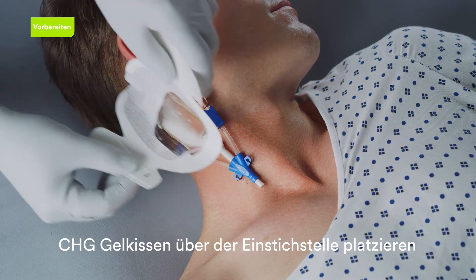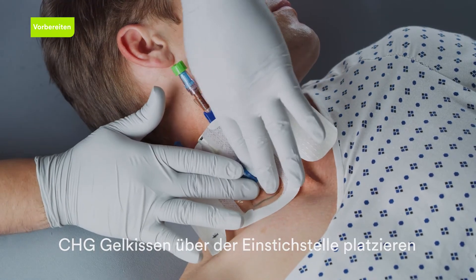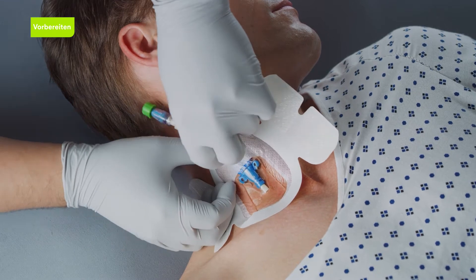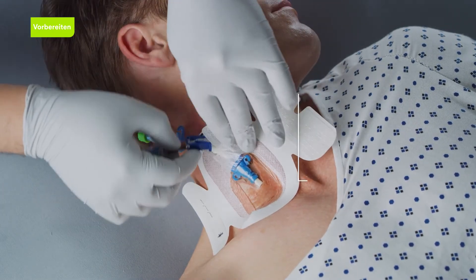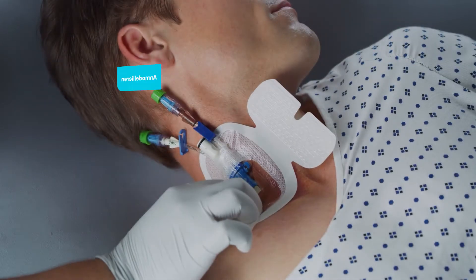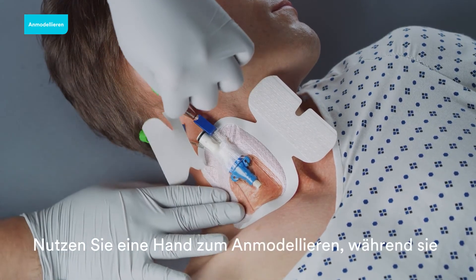Place the dressing so that the CHG gel pad covers the catheter insertion site and suture sites when possible. Be sure not to stretch the dressing during application.